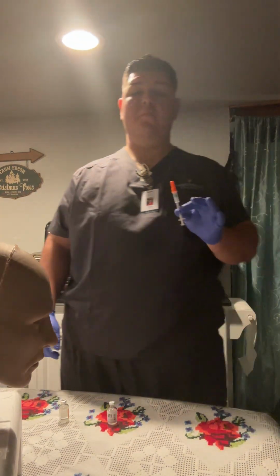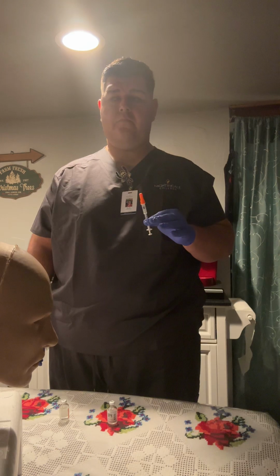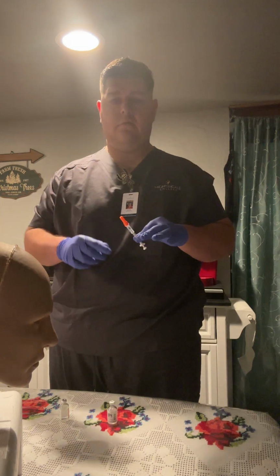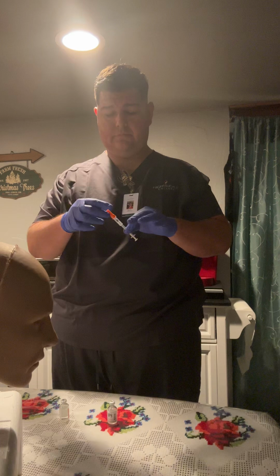So I will then remove the cap and get my vial of NPH. Leaving the vial on a flat surface, I will administer the 8 units of air into the vial. I don't want to touch any of the medication or draw up any of the fluid.